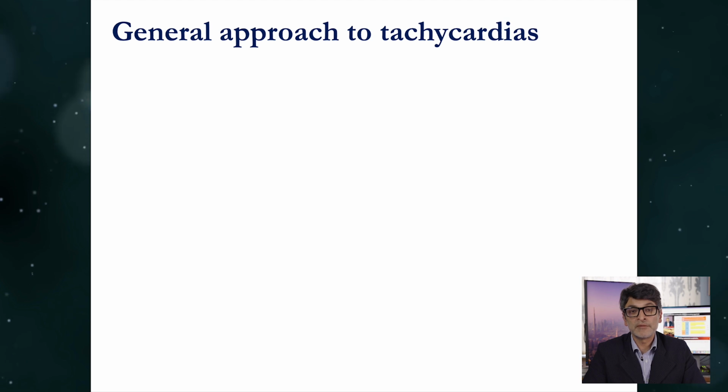Often they look alarming. The patient may look unwell, they may not. And the critical thing to remember is that actually the most common form of tachycardia that you will see in primary care is sinus tachycardia, where the heart is beating in a completely normal rhythm, but at greater than 100 beats a minute. And as a consequence, the treatment or the management is really figuring out what the underlying cause of the tachycardia is.